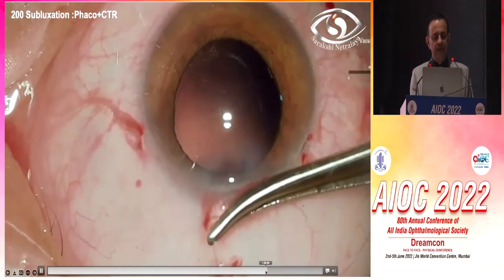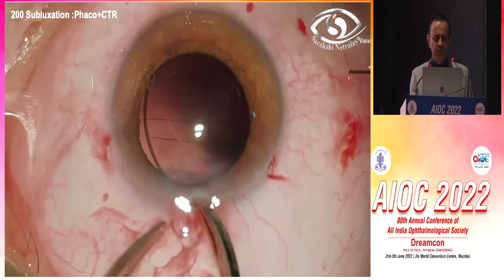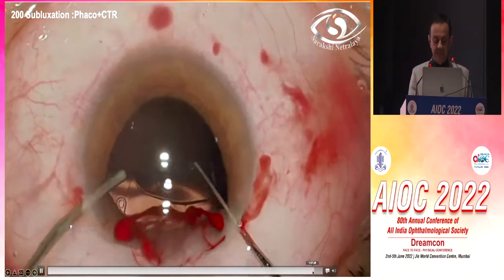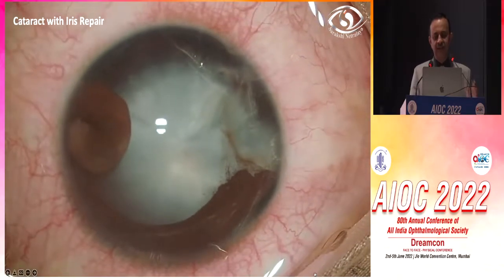Now the CTR is being put. Again, if you have a good field of view, all these steps appear so easy, even for novice surgeons. Now this is a case of a trifocal; even premium IOLs we do, I would just run through this. Now this is another important case of a cataract with an iris repair.